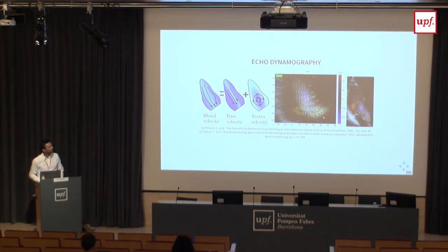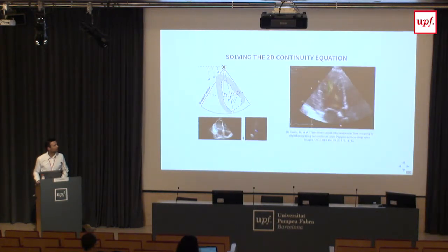I personally don't think this is particularly accurate, but it has the advantage that it only needs the Doppler data, and also it has already been implemented in some commercial systems. I'm not sure how widely used this is, but it does exist. Now, actually more used than this and partly related is the work by Dr. Bermejo, who was speaking yesterday, and Damien Garcia, which you can call just vector flow imaging.